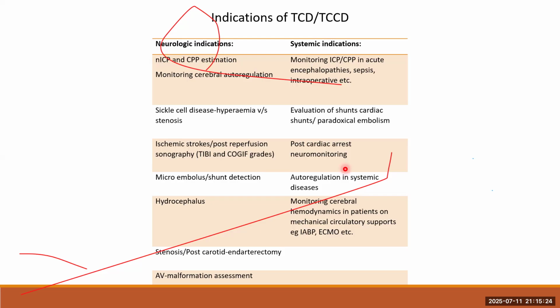If I am not mistaken, in the 24 hours post cardiac arrest, they have tried to maintain that using transcranial Doppler, trying to achieve good CPCs, cerebral performance categories. Autoregulation status can also be identified, as well as monitoring cerebral hemodynamics in mechanical circulatory support devices.